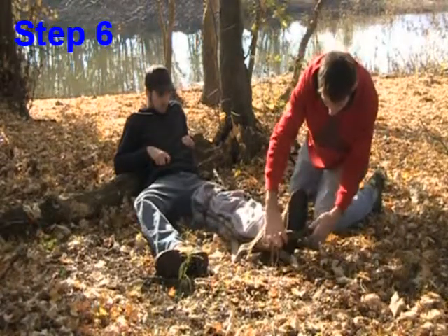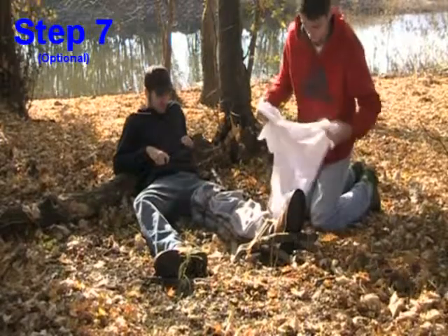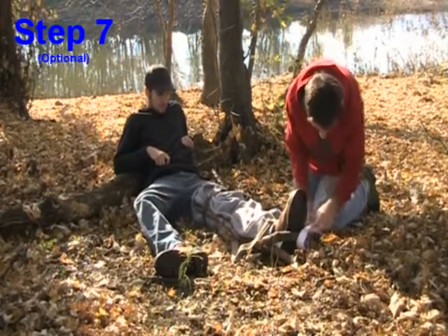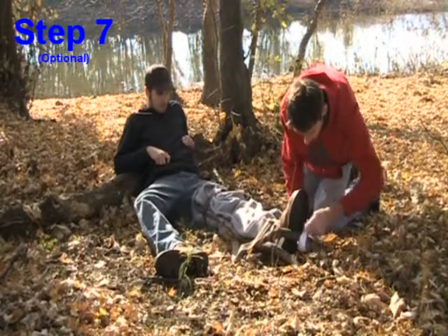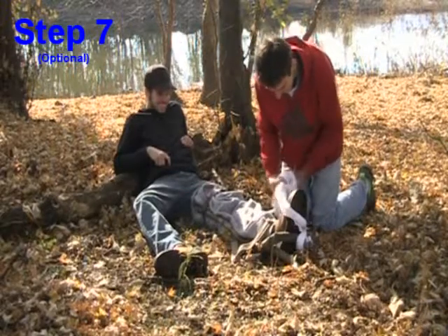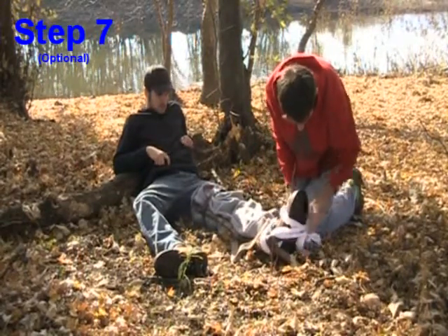Last, place the shortest stick at the bottom of the foot. Secure it in place with a t-shirt, string, or whatever material you have. This prevents flexion of the foot, which can increase pain. If you have no extra material, this step may also be skipped. To secure the last stick, start by securing the longest stick on the outside of the foot. Then take the t-shirt to loop around the foot and secure it to the stick on the inside leg. Make sure all loose ends are tucked in to prevent either party from tripping while exiting the woods.